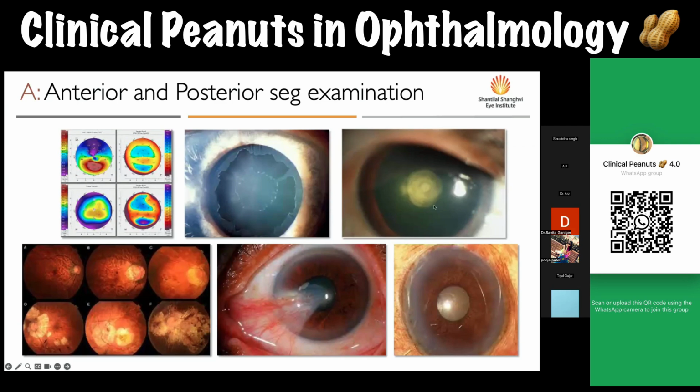In any case like this, like a polar cataract, where you anticipate that there is a likelihood of the PC tearing, we under-promise and over-deliver. Therefore, even if you keep a toric lens on, it's best to always have a monofocal lens as a standby.